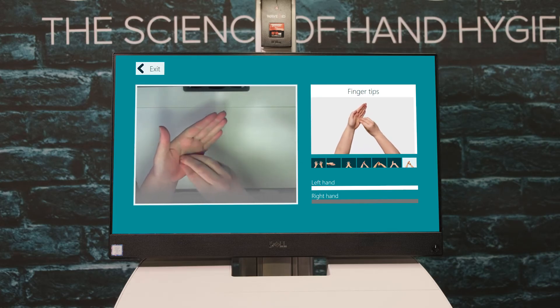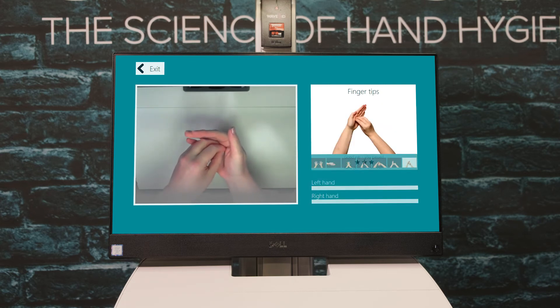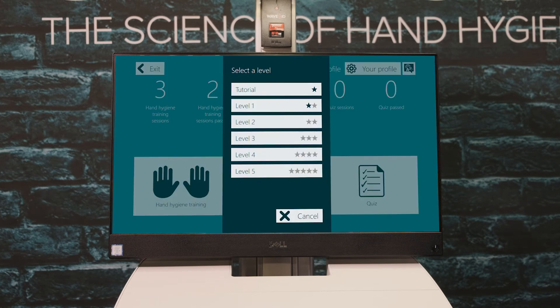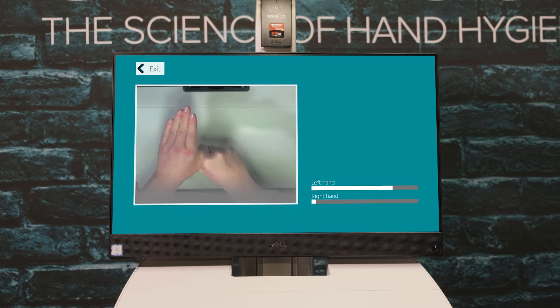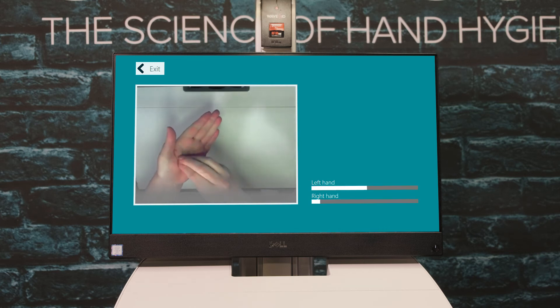Completing a level enough times will unlock the next level, which will be more difficult than the last. You will then be prompted to train further. As you progress through the difficulty levels, you will be given less time to complete each pose, and on-screen hints will be removed with each subsequent level that you pass. By level 5, the user will need to know the hand hygiene technique from memory without any help. Be sure to emphasize your movements to improve your outcome.